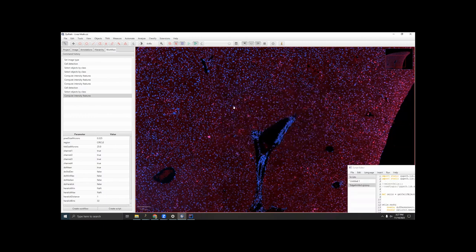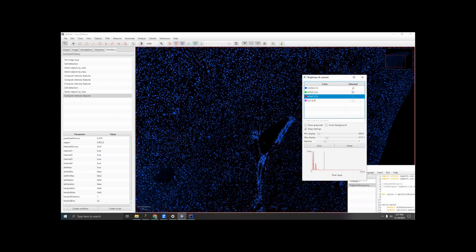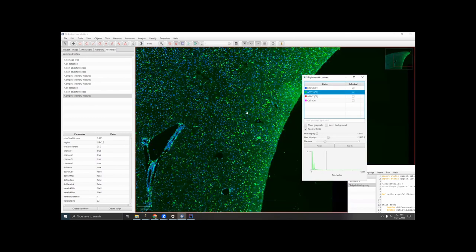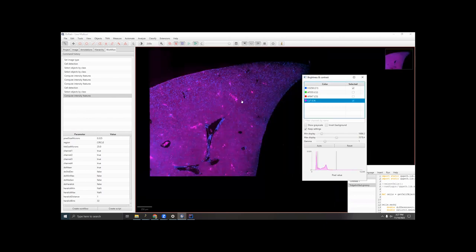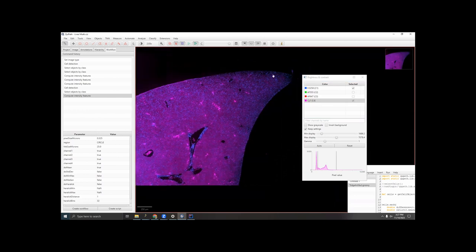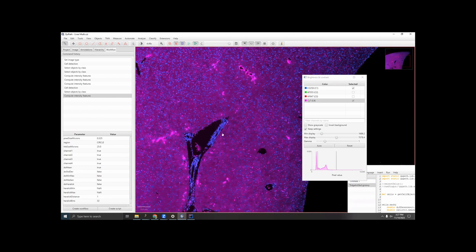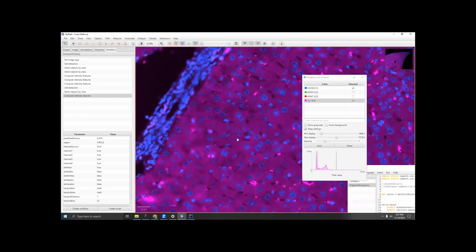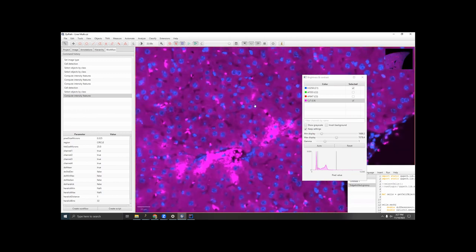The other thing you might want to do with a script like this is look at other channels. We've been looking at the AF647 channel, but the green channel also shows the exact same edge artifact. And interestingly, the Cy7 channel actually shows an almost inverse artifact where the edges are dimmer, but the middle of the tissue is a lot brighter with this like nebulous background staining that's everywhere. That makes it a little hard to find the true positive cells.